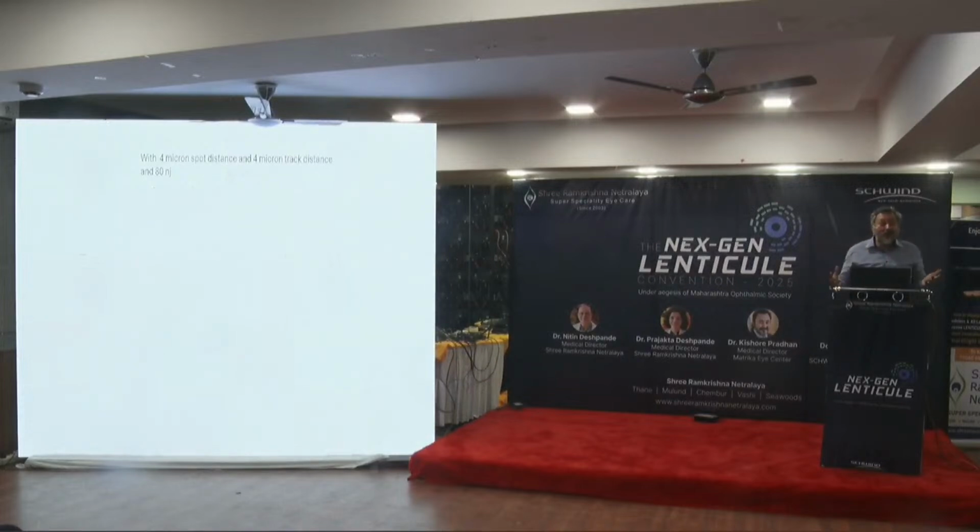But after fighting so much and getting the eye tracker and the cyclotorsion, the results were slightly better, but not as good as what we expected. We always thought if the Visumax had an eye tracker and cyclotorsion, the results would be much, much better. But then we realized we got the stuff, and it's not happening. So the only thing we could think of was to reduce the energy. The first thing that came to our head was to reduce the pulse energy.